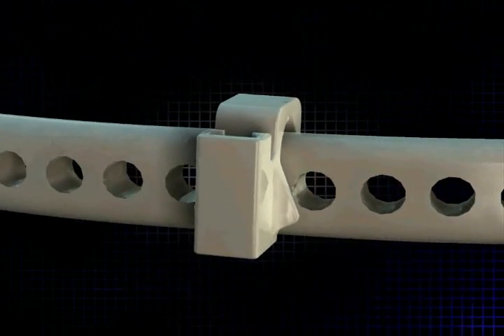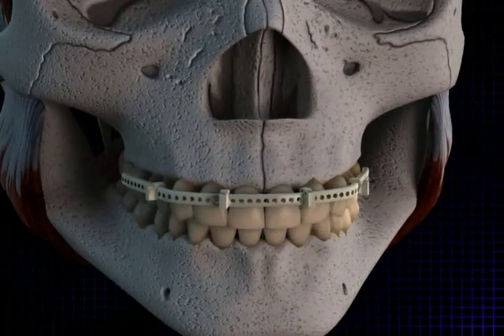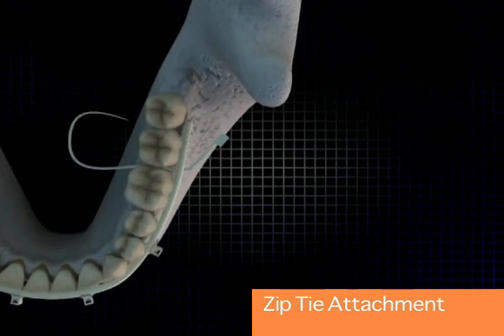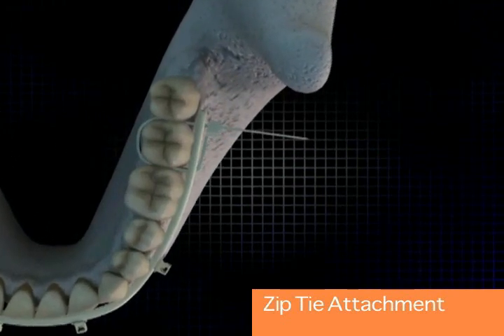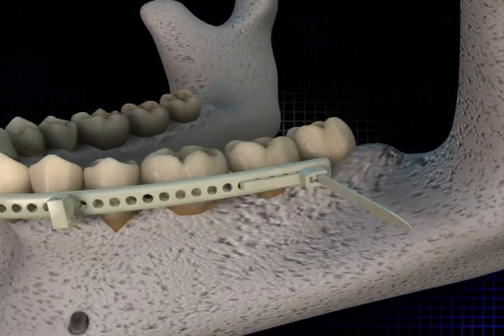These swivel slightly to allow the surgeon to align the brackets however they need to. The zip tie attachment is actually used to create a circum-dental ligature in place of wires, and this securely fastens the arch bar to the tooth bearing segment.